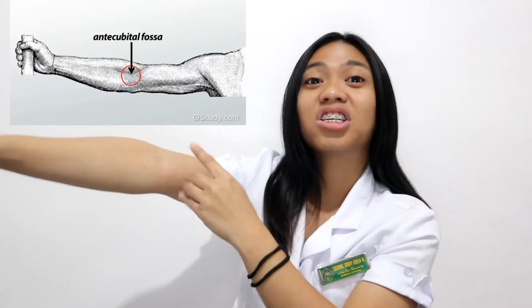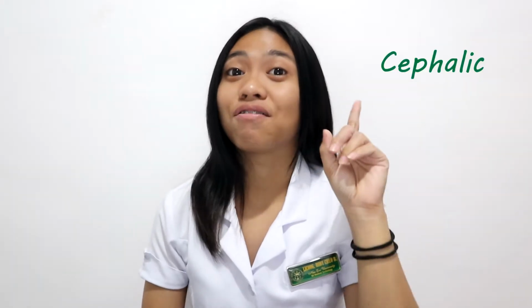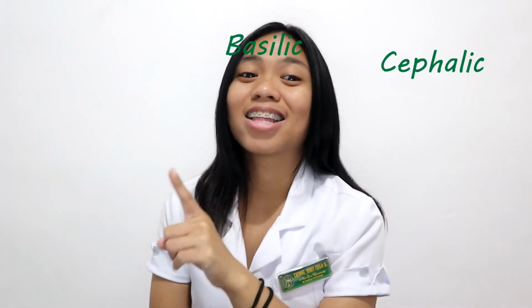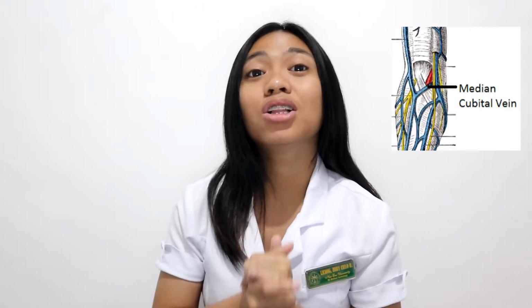The location where venipuncture is performed is the antecubital fossa, which is the inside of the elbow. There are three veins that a phlebotomist can choose from, namely the cephalic, basilic, and median cubital vein. The most commonly used vein is the median cubital vein.